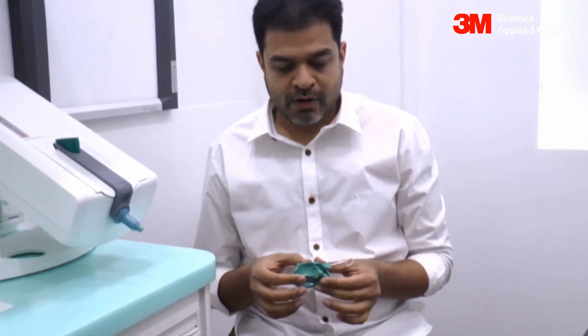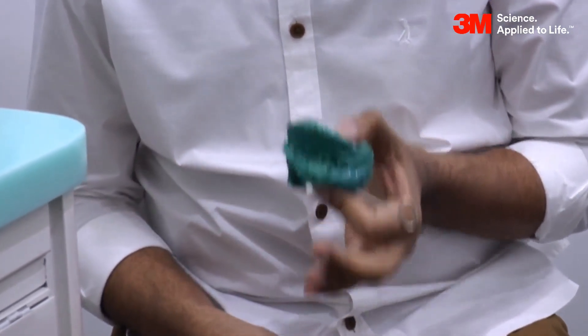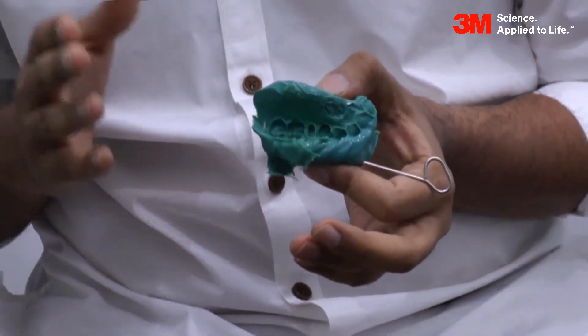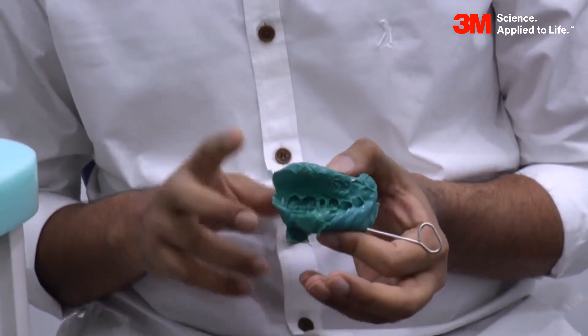The big concern that most labs have when we send this impression is that they do not know how to handle this kind of tray. What we need to do first is explain to the lab that this material is very accurate, and if it is accurate, your die stone is going to be more stuck to this than to any other impression. This means we need to reduce the surface tension before pouring — to do that, dip the impression first in soap water. Once the soap water step is done, pour the side of your preparation first and let the die stone set.